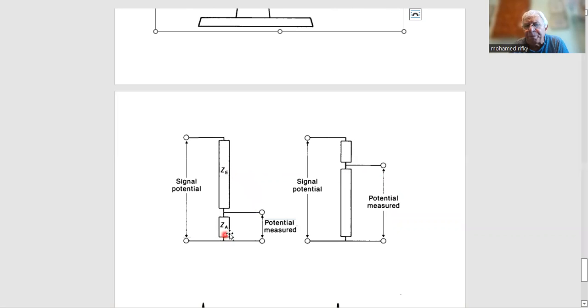Suppose the ECG has a higher impedance than that of the equipment, it will definitely attenuate the signal. Whereas whenever the equipment impedance is higher than that of the ECG, it will not be much affected. You see, sometimes the ECG electrode is loose or there is no proper gel to minimize this resistance, this attenuation, which will increase, so it is much better whenever I use an equipment with high impedance.